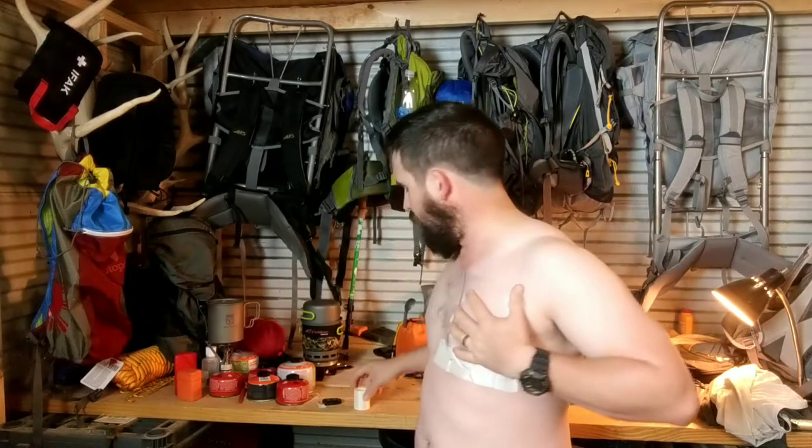So the full sandwich bag is going to go pretty much smack dab onto my wound, all right? Like I said, I'm going to go ahead and tape three sides of this. And while I'm doing that, I'm going to try and keep the person talking. If they're conscious, I want them to know that, hey, you're doing okay, buddy. We're going to make sure that you don't die by treating your sucking chest wound.